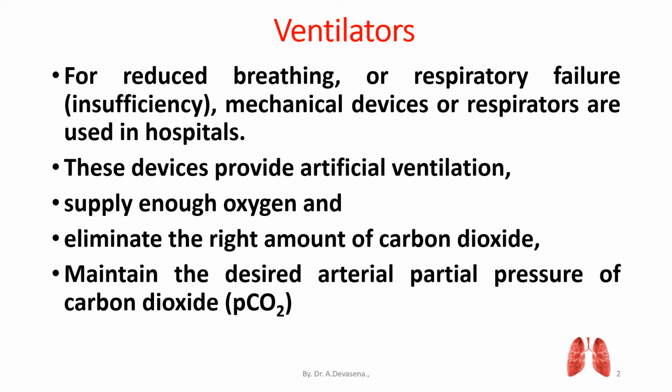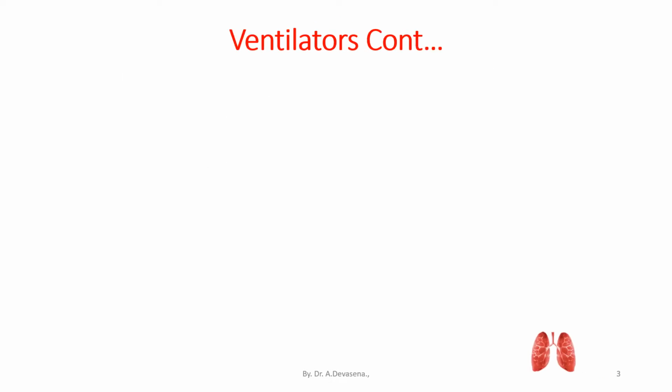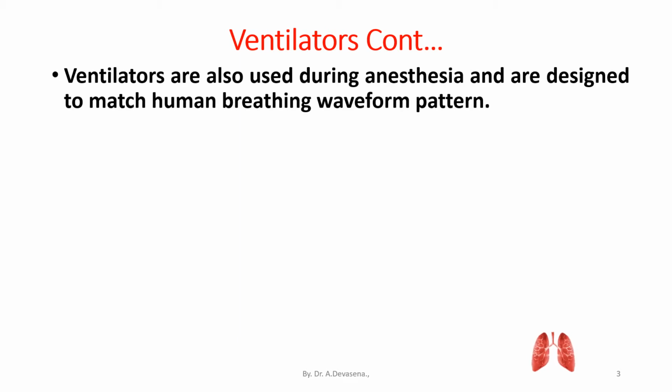They maintain the desired arterial partial pressure of carbon dioxide, that is PCO2, and desired arterial oxygen tension, partial pressure of oxygen. Ventilators are also used during anesthesia and are designed to match the human breathing waveform pattern.